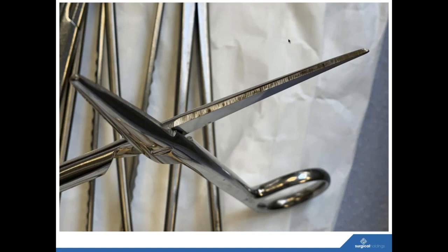And of course, man-made issues again in relation to maintenance. This is a scissor that looks very, very overground. The sharpening is so coarse that it's almost created serrations, and it wasn't meant to be a serrated scissor, but it's created almost serrations along the blade where corrosion has started to take place and staining has started to take place. So obviously, very early stages, but nothing should be finished like this.